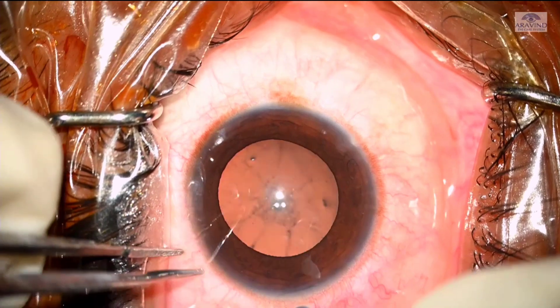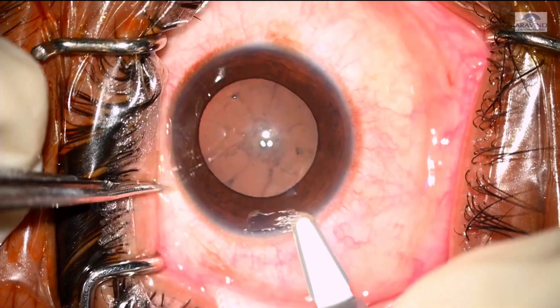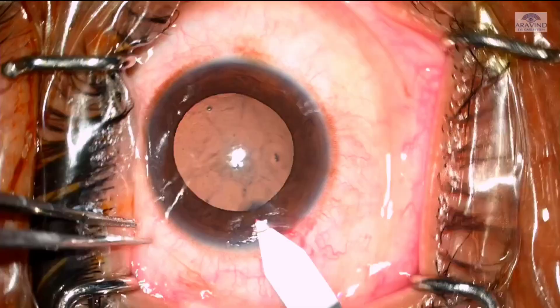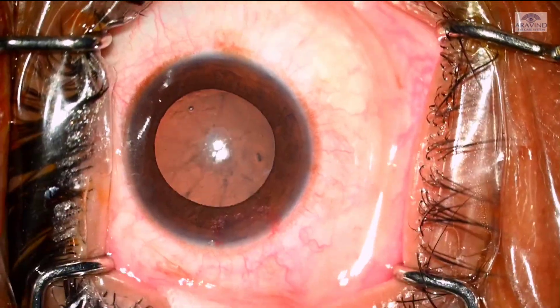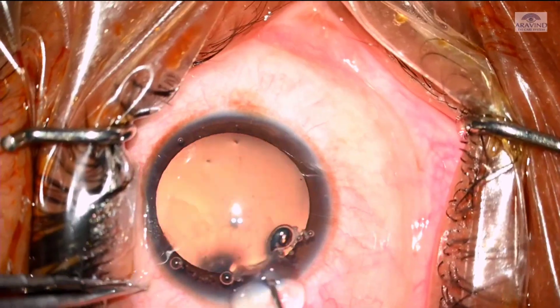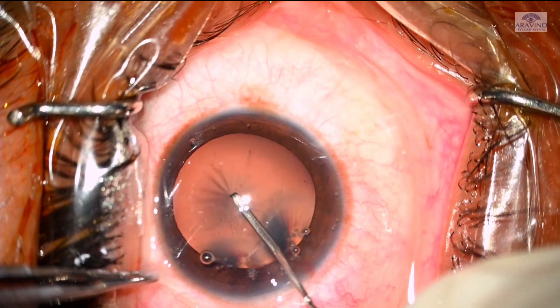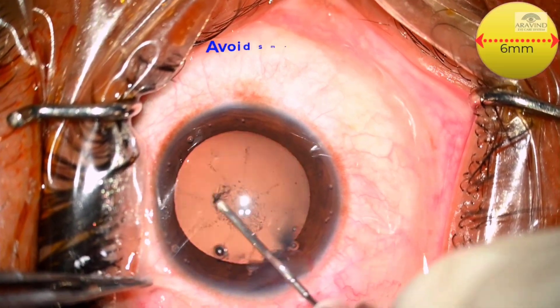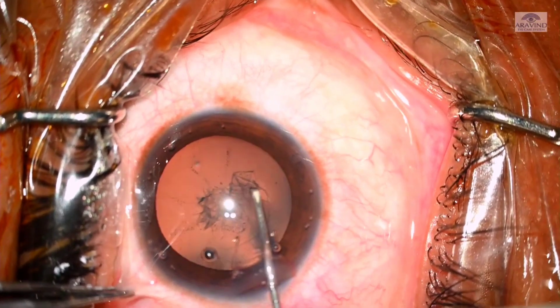A triplanar clear corneal incision is made using a crescent and a keratome. Viscoelastic is injected. Capsulorhexis is done using a 26-gauge cystitome. We aim to create a 5.5–6 mm capsulorhexis. A small capsulorhexis should be avoided due to the increased incidence of post-operative anterior capsulophimosis.